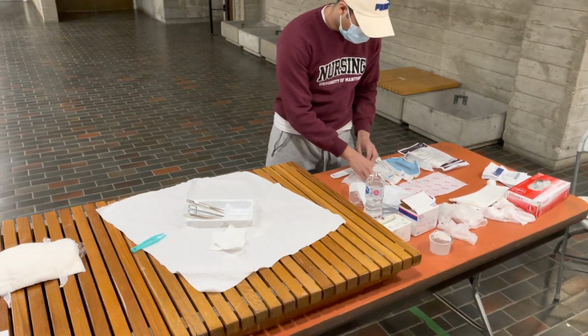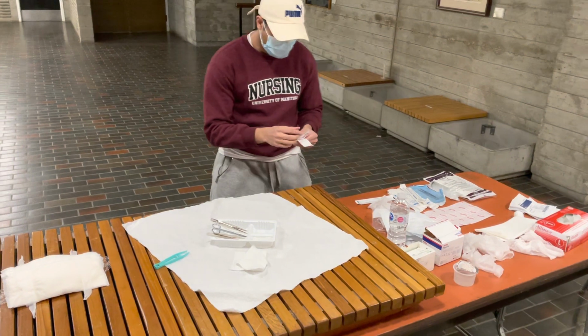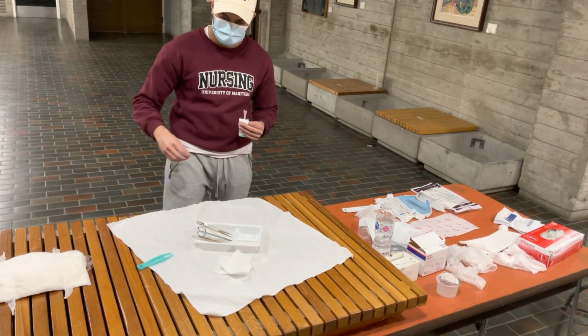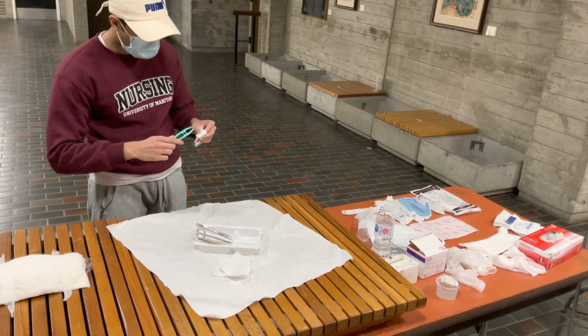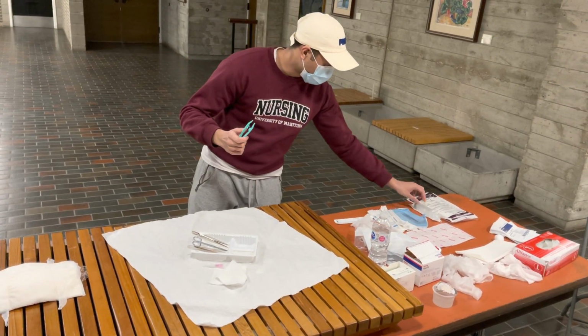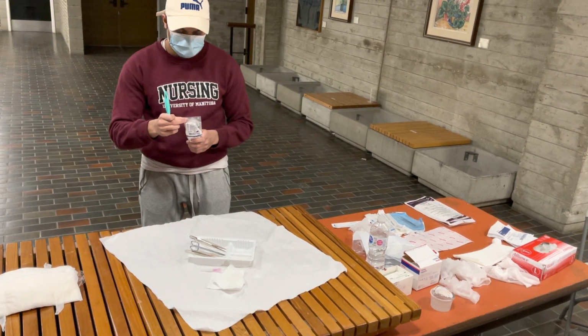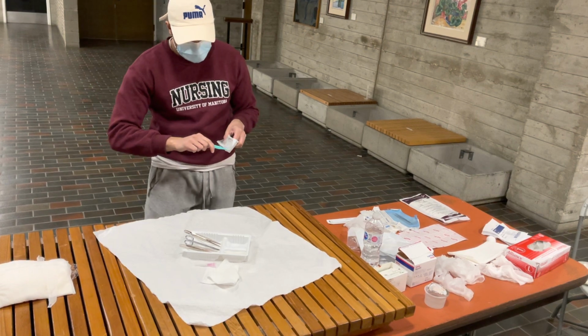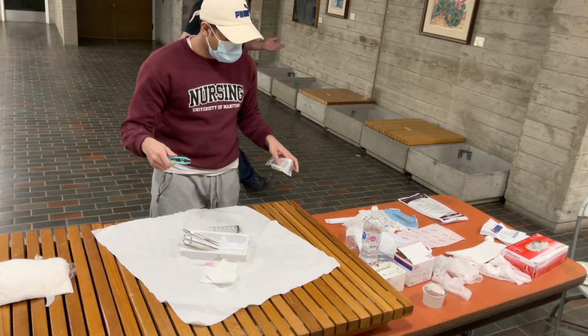So we're just going to now grab our cap as well and add that in. Then we're going to grab our syringe as well and add that in. Our 30 cc syringe.